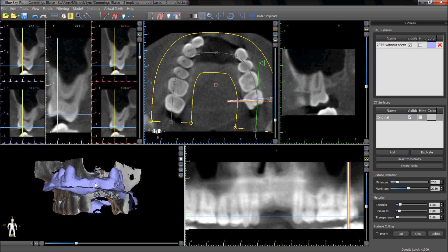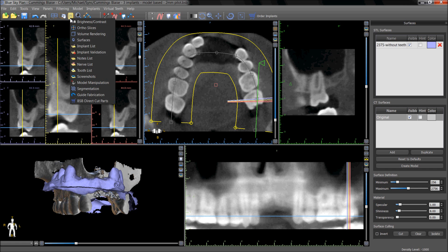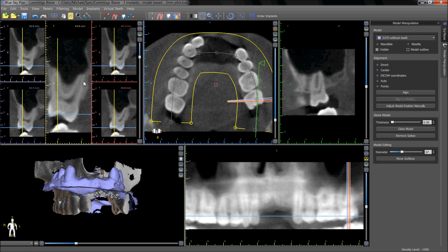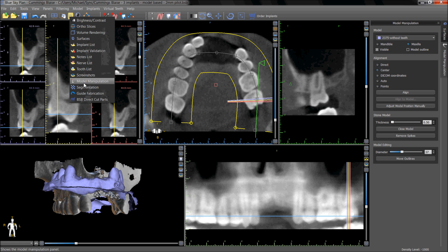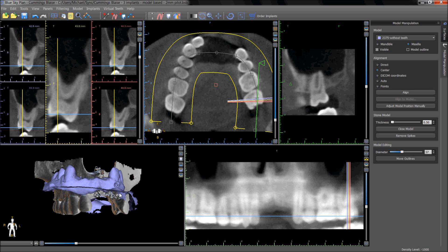When a model is imported, the model manipulation panel will automatically open. It is also accessible via the panels drop-down. The correct model should be visible in the model drop-down list, the draw type should be selected, and the points functionality should be chosen.